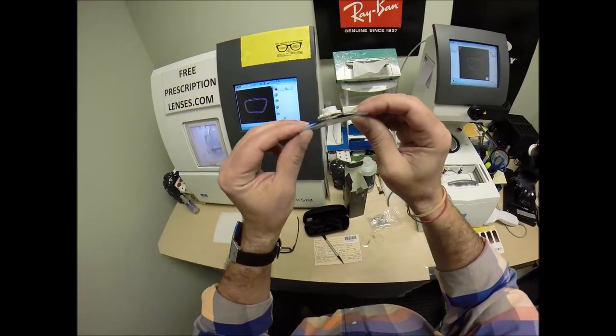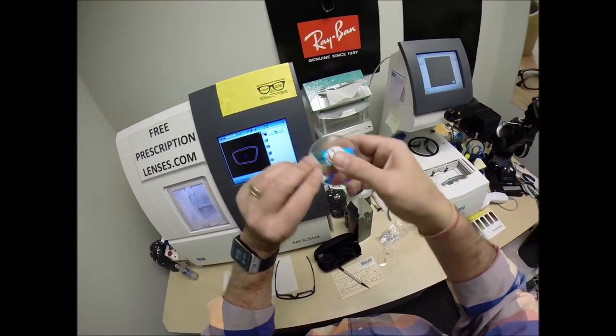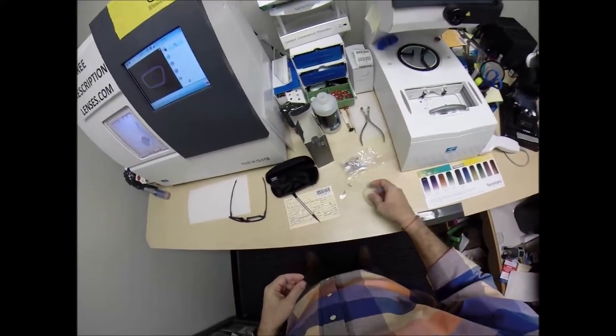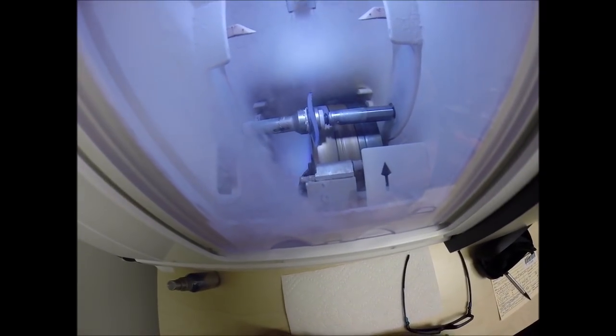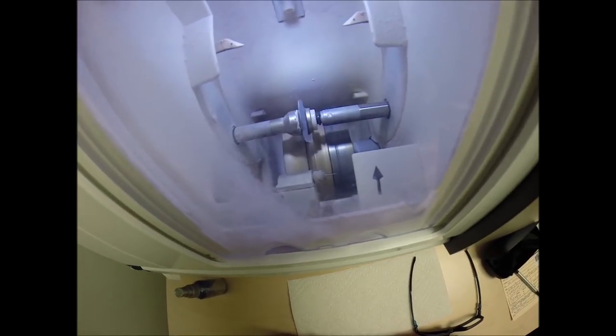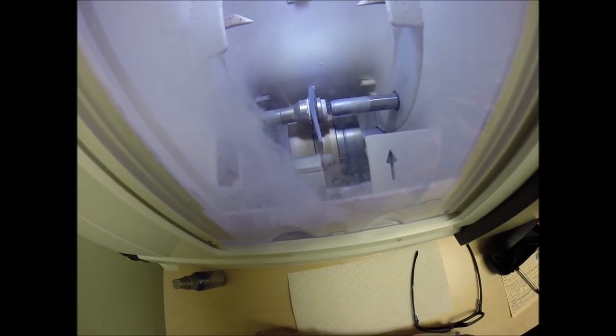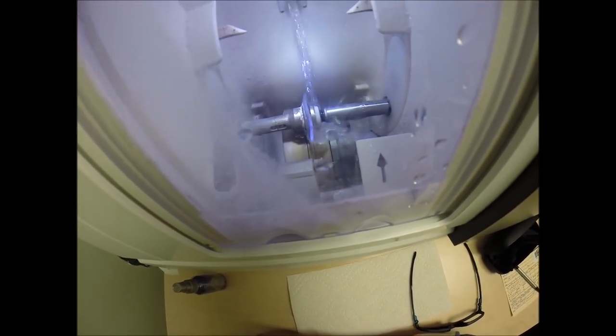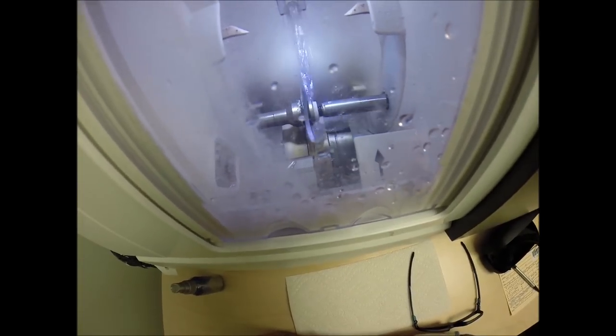Your lenses are made out of polycarbonate, which is 40% thinner and lighter than regular plastic. They're virtually unbreakable, high impact ballistics grade lenses. Your lenses also have 100% UVA and UVB protection built into the lens. This is permanent and never needs to be reapplied. Your lens is now on the bevel wheel, getting the knife-like edge. Water has begun spraying.